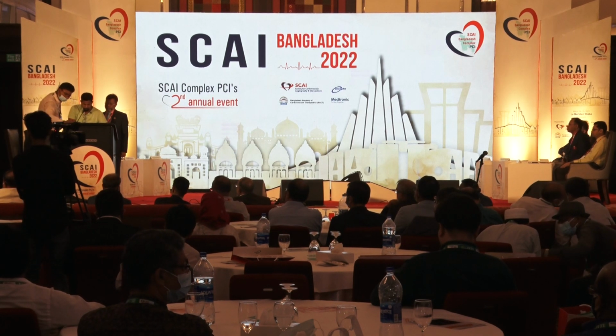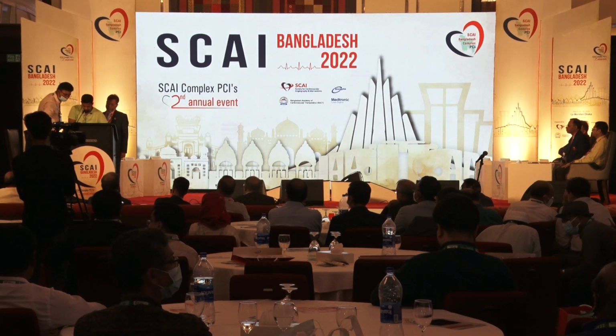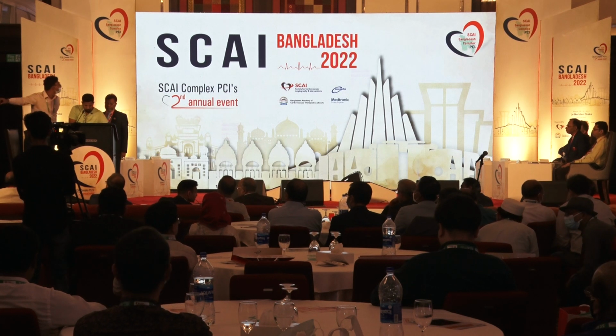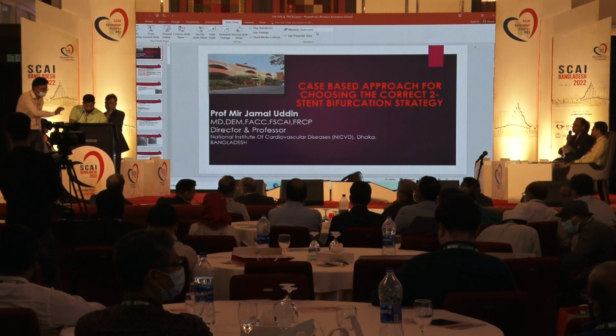So what I learned was if you put in the larger balloon first, then you're more likely to get the smaller balloon through the 6 French. But in those cases, honestly, a 7 French just makes it easier. So, technical issue has been solved.